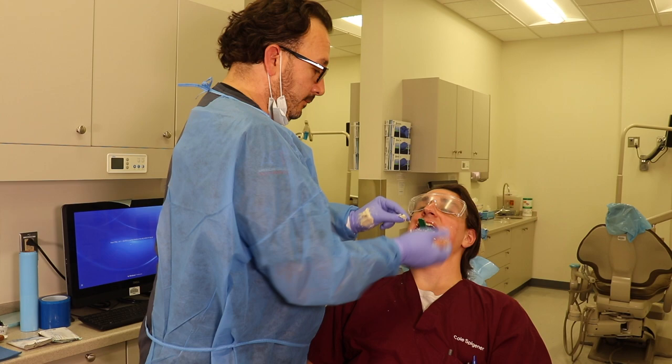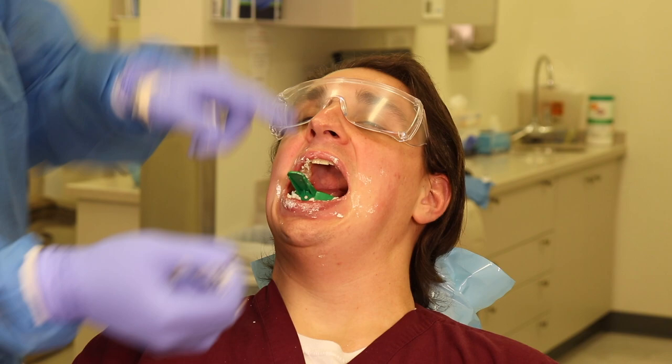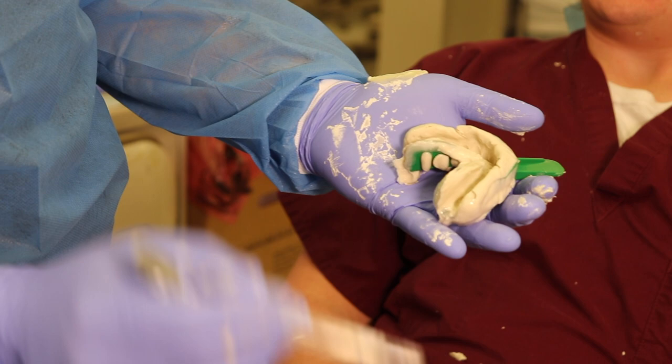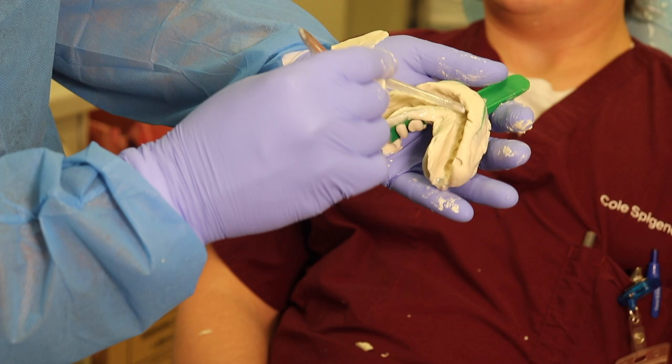I take the excess off. Open up for me. Once it's set, it's pretty much set. Again, I come from the back, I snap it in the outside from the back, and then I take it from the front. And what do I get? I got one little bubble here that it's not in the way of what I'm looking for. But look how I get the whole vestibule very well, the whole lingual vestibule as well, and all the teeth perfectly centered in the middle of the tray.